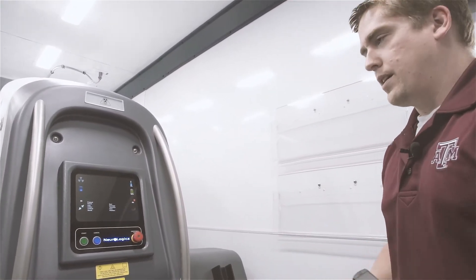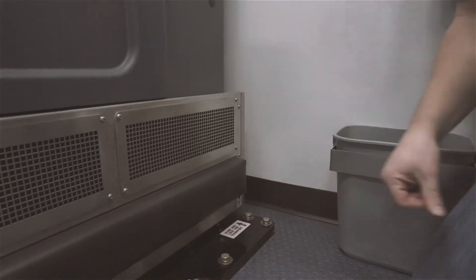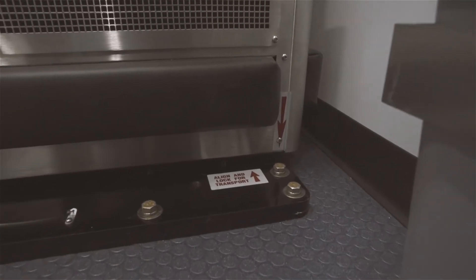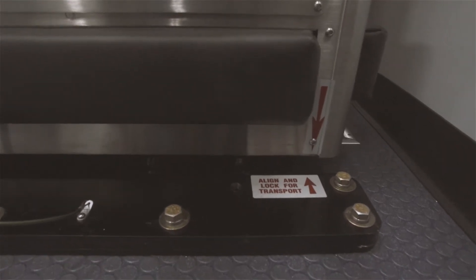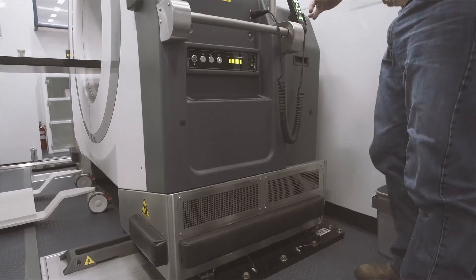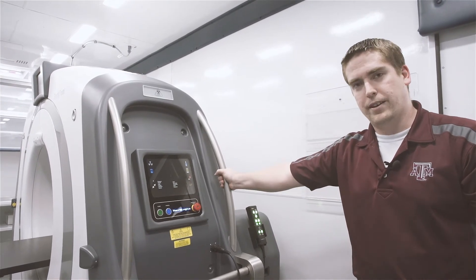Once we're done with the scan and want to put the scanner back into transport mode, you'll notice at the end of the lock plate there are alignment arrows that need to line up before you can lock the scanner into place. The arrows are about a couple of inches off, so I'll slowly move the scanner until they align, then put those pins back in. I'll do the same on the other side so it's secured and ready to go back down the road. Note: this is only necessary when you're ready to start traveling — not between scans and between patients.